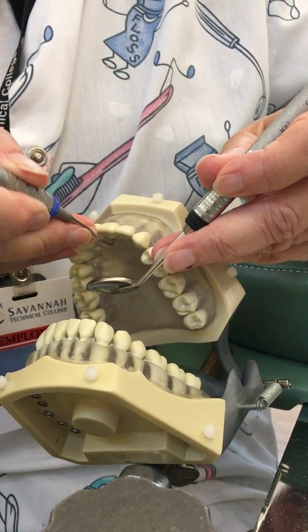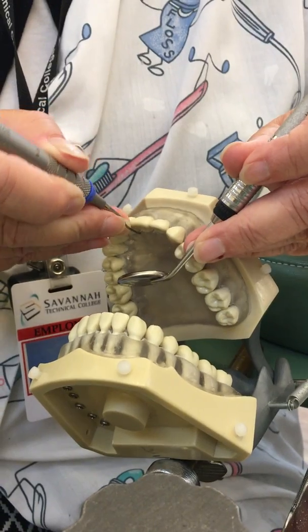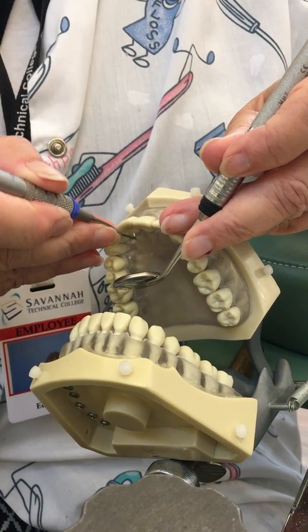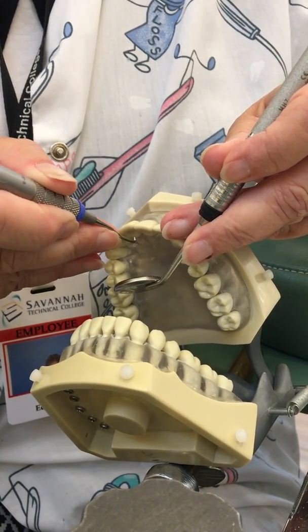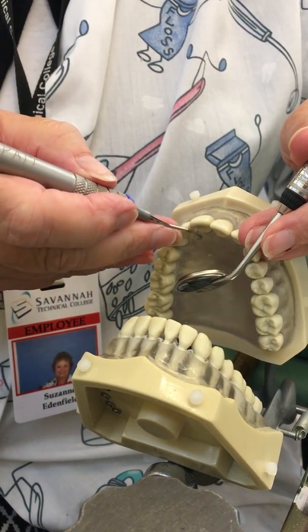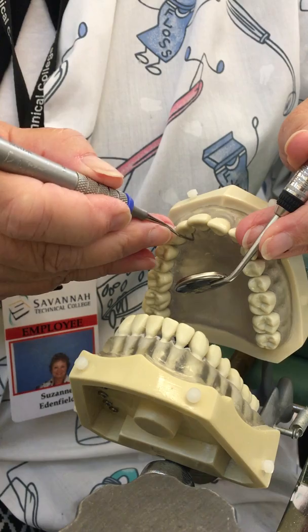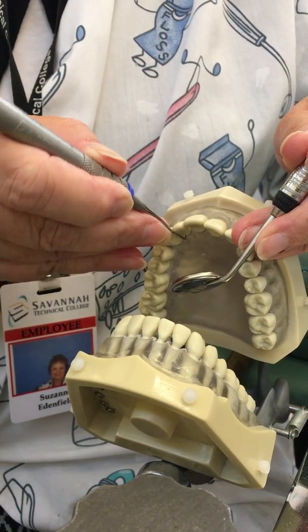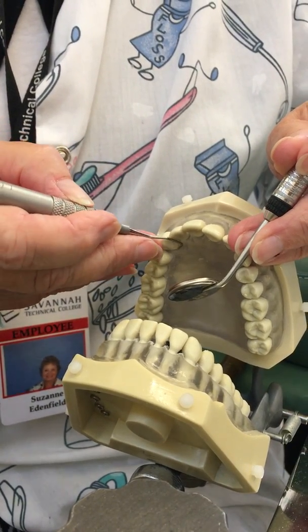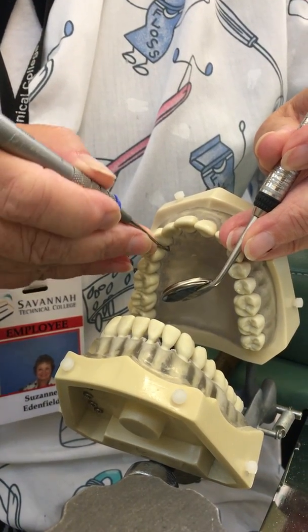Insert with the toe apical — your toe stays apical at all times. Your fulcrum should be as close to the working area as possible without being directly over where you're going to finish, so if you see that happening just move your fulcrum over slightly. Hand pivoting on my fulcrum, hand pivoting on my fulcrum.